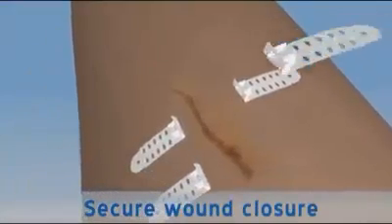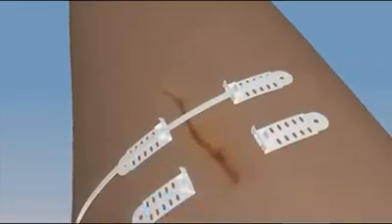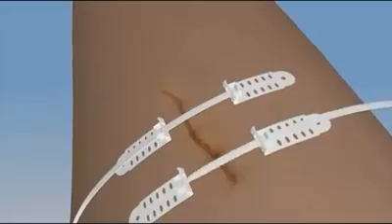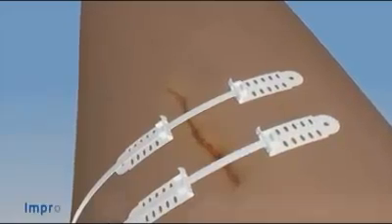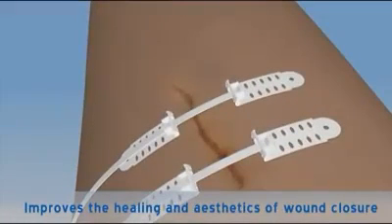The Top Closure 3S system may also be applied following surgery to secure wound closure where the skin has closed under tension. The system is used to ease and secure reconstructive and aesthetic procedures and to improve the healing and aesthetics of wound closure.